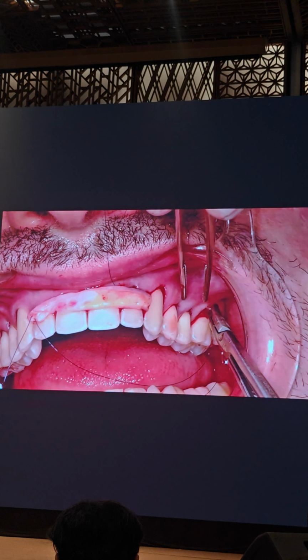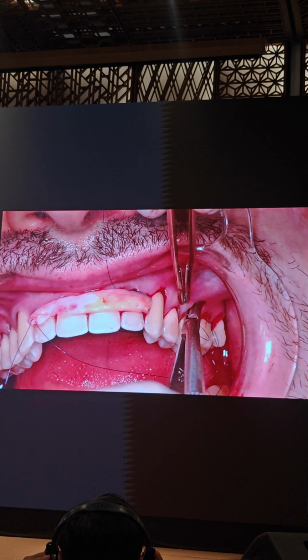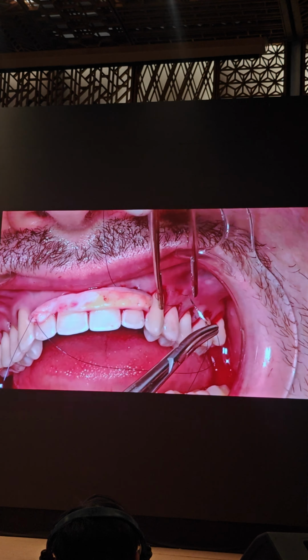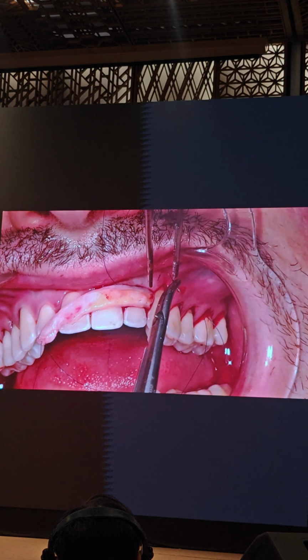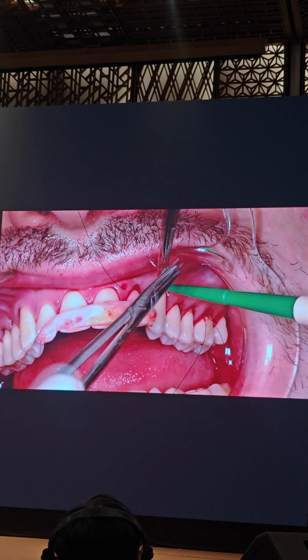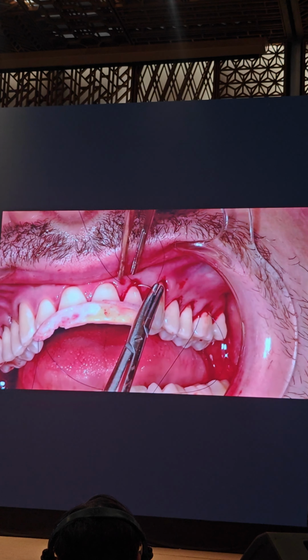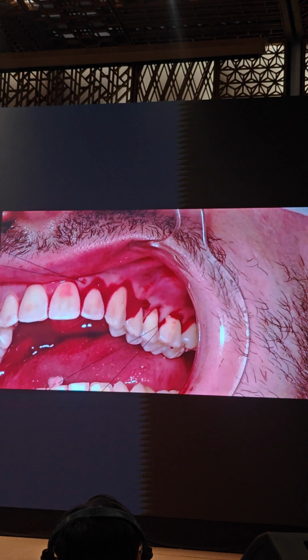So you've been going one way in the tunnel, so now you're going the other way. So within the tunnel, you navigate by the non-cutting extremity of the needle, of course.